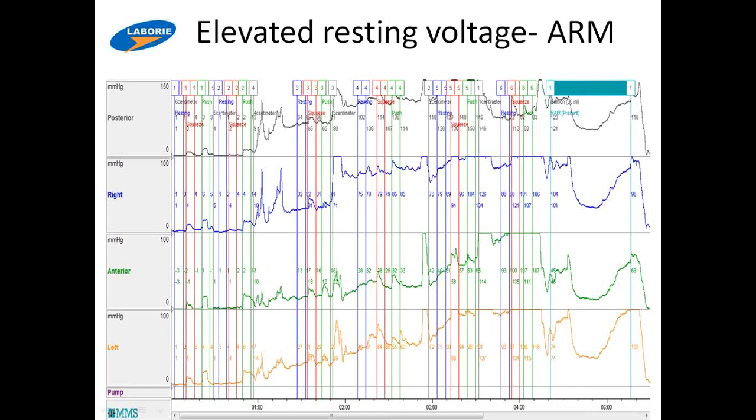But here's her manometry. Sorry, that's her weird EMG. But here's her manometry. Baseline pressures go up at 3 centimeters. Again, it's a pretty common sphincter length. And mean maximum rest was 100 millimeters of mercury. Again, too high. The squeeze, 135, and the rectal anal inhibitory reflex was super present, if you would. So almost exaggerated.